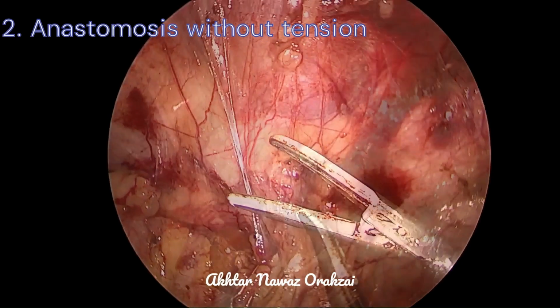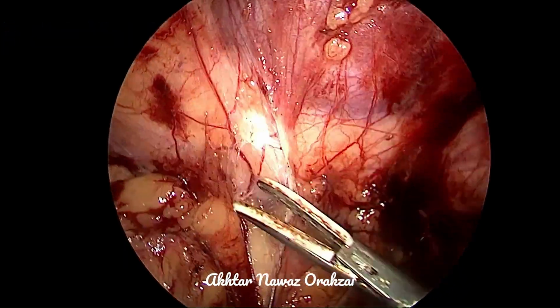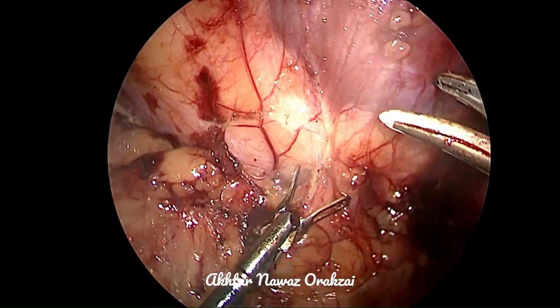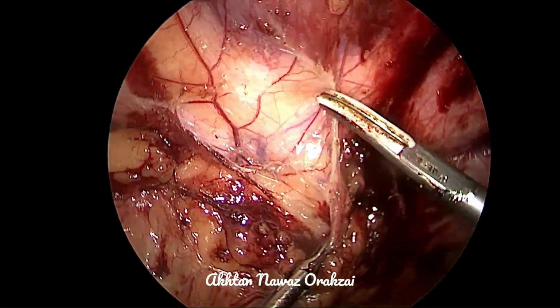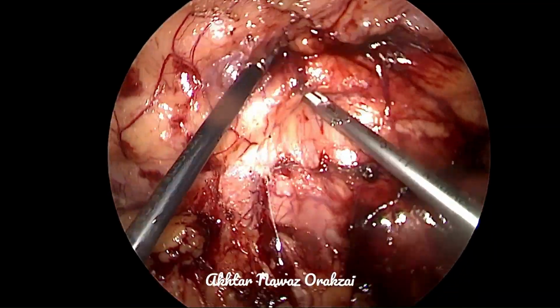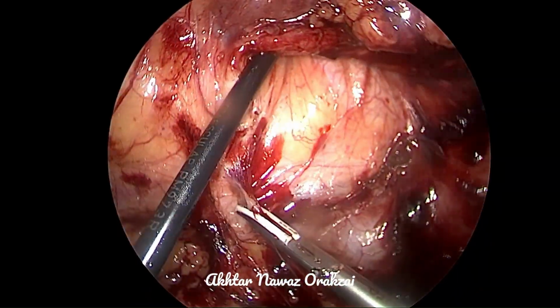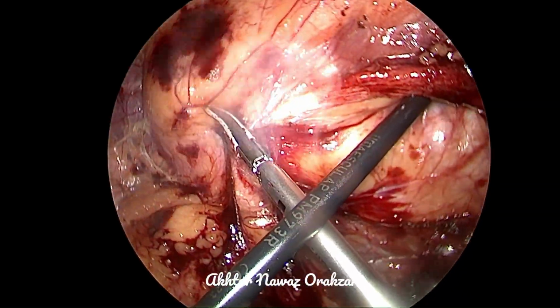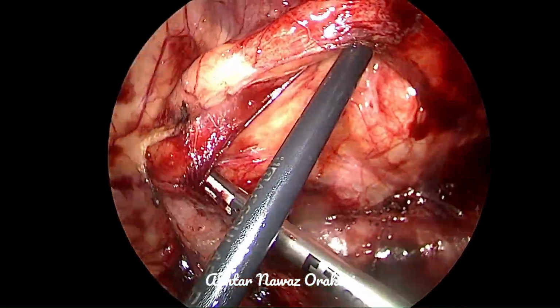Second is anastomosis without tension. Do not cut the ureter or the pelvis so much that they are difficult to oppose. If they are difficult to oppose, the anastomosis will be under tension and the blood supply will be compromised because of the tension, and hence the procedure will fail and there will be recurrence of the PUJ obstruction.